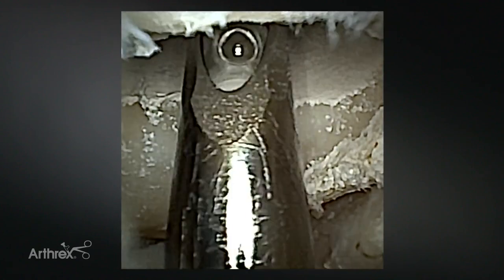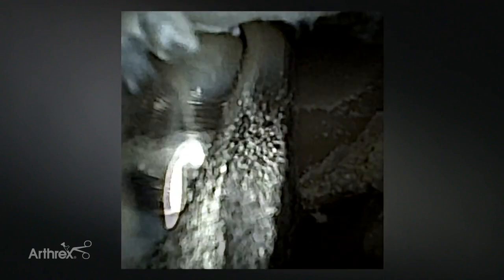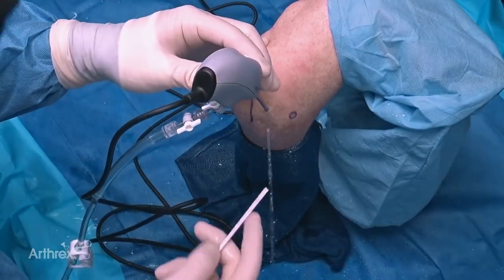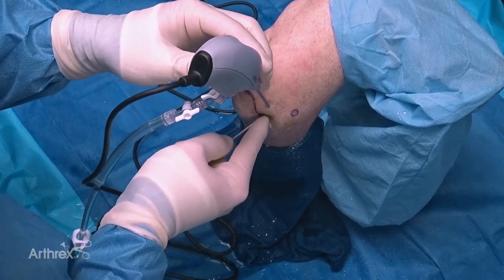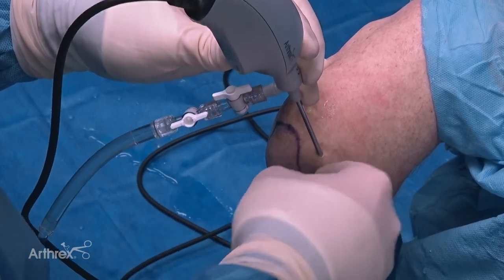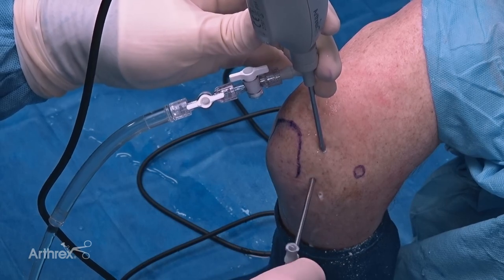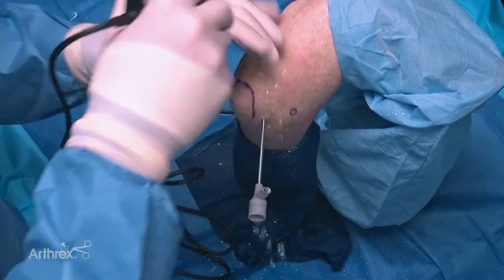Even in this difficult and arthritic elbow, it still does a really good job of removing tissue. The lightweight nano saber shaver pairs well with the small handle - it feels very ergonomic when paired with the nanoscope, both instruments are similar size and weight, giving you excellent control. It feels balanced in the hand and lets you be very precise. One of the benefits of having smaller instruments is it allows you to put your portals closer together - you can fit two soft spot portals down here without overcrowding, and I'm going to switch the camera to the additional soft spot portal.